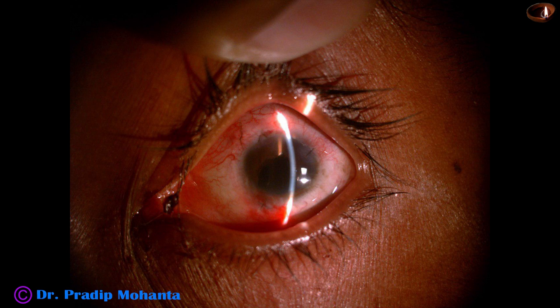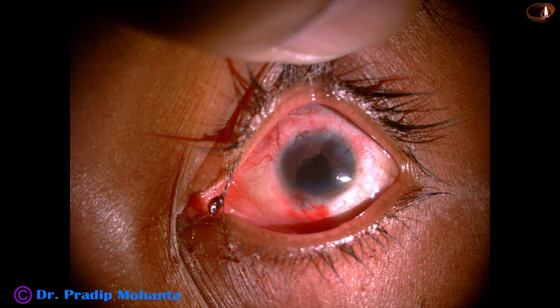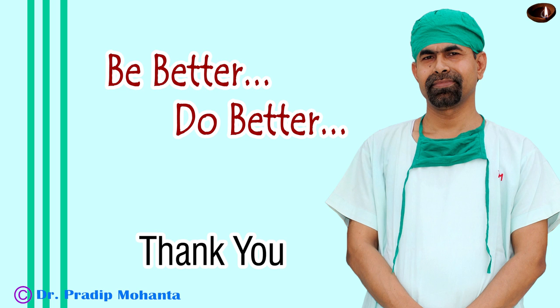These are the postoperative pictures. The cornea is clear, the chamber is nicely formed, and the sphincterotomy has kept the pupil nicely dilated. The patient is very happy. Thank you very much for your attention. I hope this video will encourage you to take up challenging cases and you will not be afraid of cases with microcornea. Thank you once again for your attention.